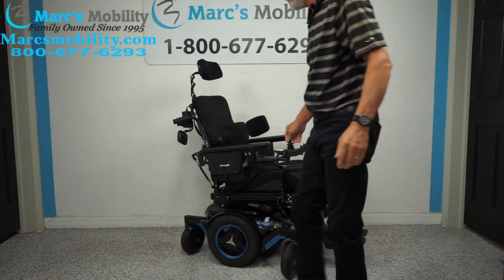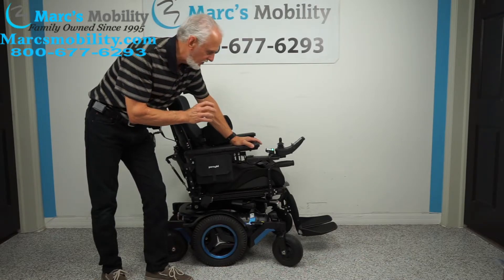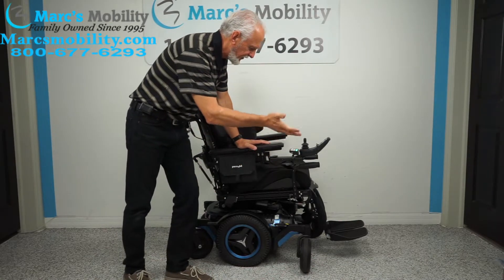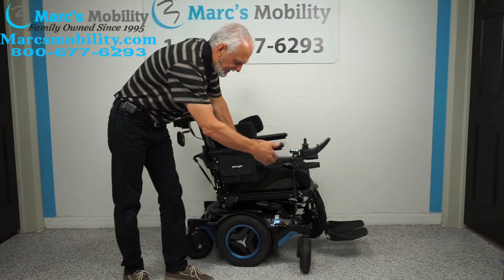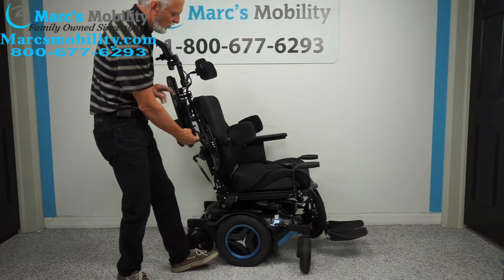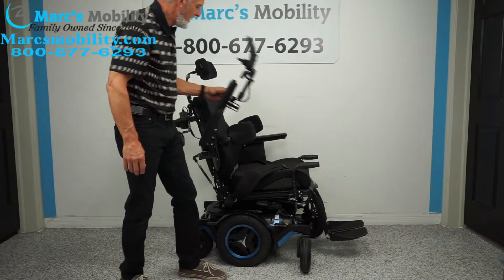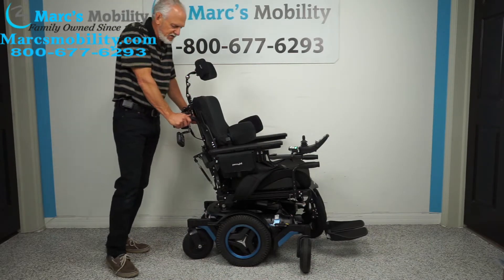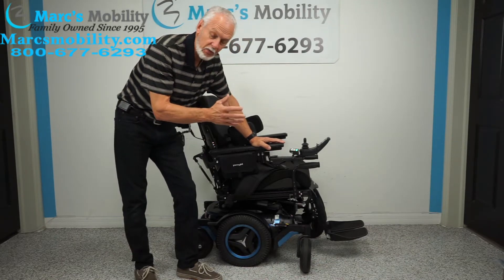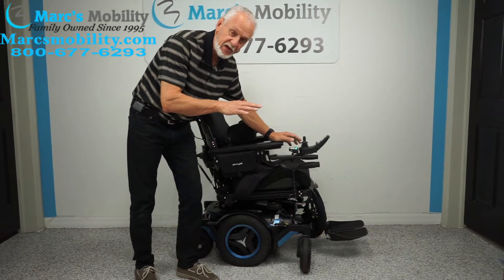Let's recap. This is a Permobil M5 — one of the top power chairs. It has 13 miles on it, a 14-inch seat lift, electric tilt, electric recline, electric feet, the full lighting package, solid tires all around, anchor points, swing-away joystick, flip-up arms, two bags, lateral chest guards, grab bars, upgraded safety belt, fully adjustable headrest, push bars, and the attendant control. Highest quality you can get.